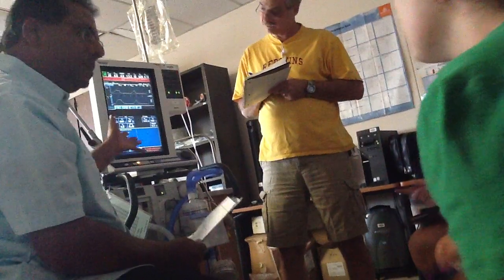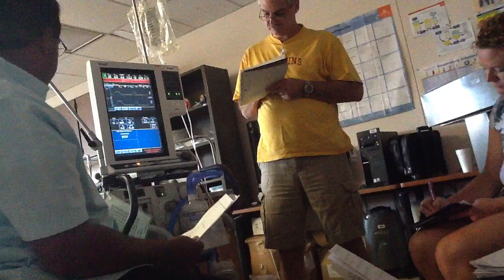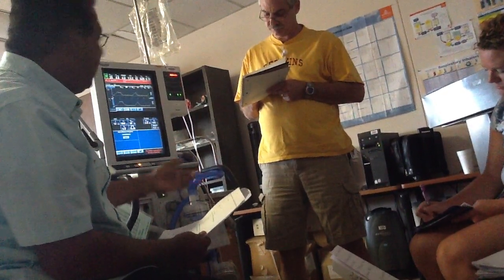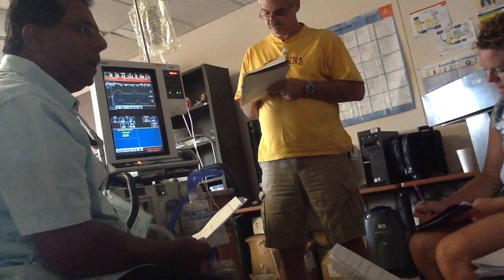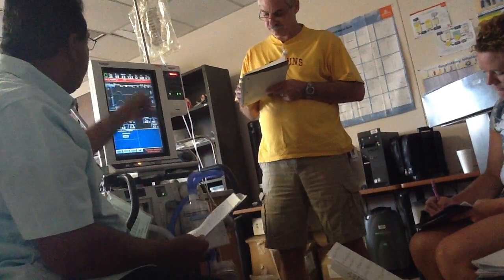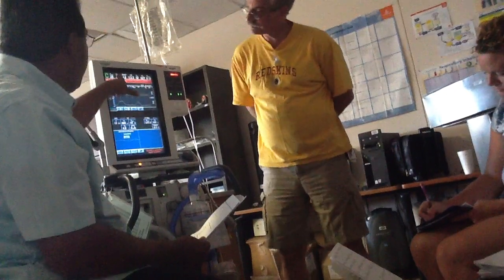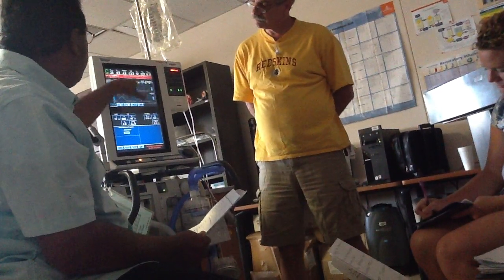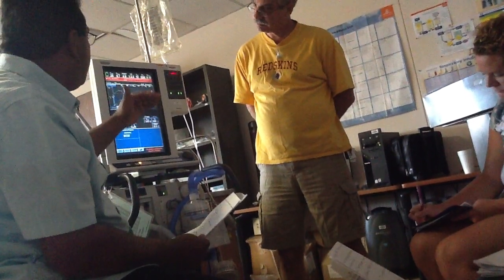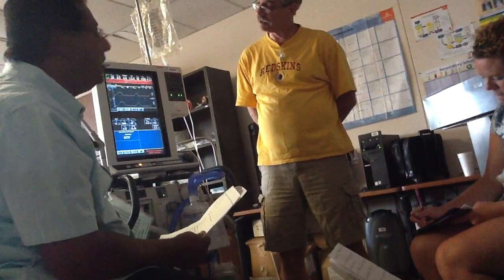Okay, you are switching this particular patient to pressure control, right? If this is a real patient, plateau minus PEEP is the initial PI. Your plateau is 23. How did you get that number? By pushing the inspiratory hold. It pops up with the 23. Plateau is 23 and the PEEP is 5. Your PEEP is right there. So 23 minus 5 will be your initial PI.